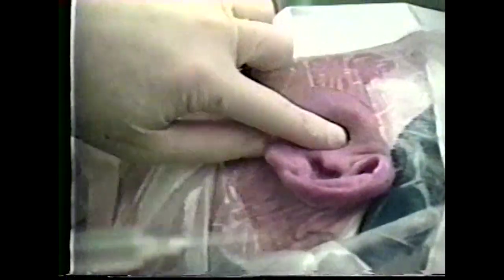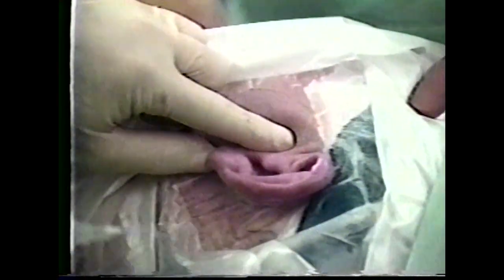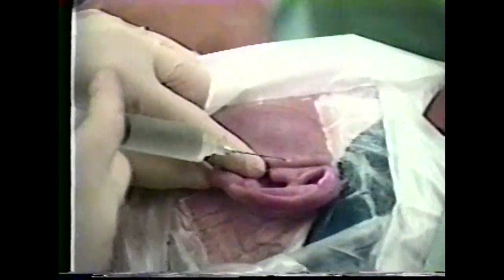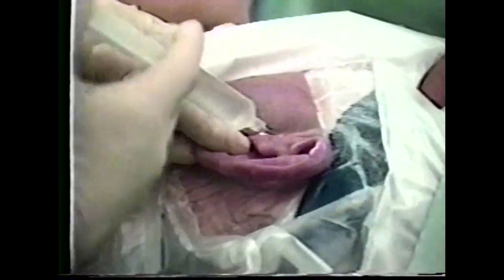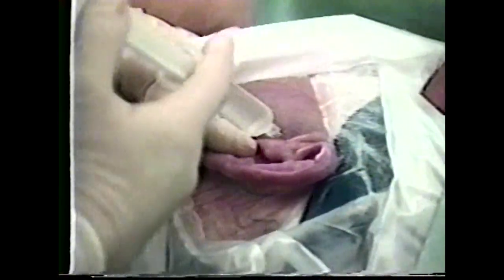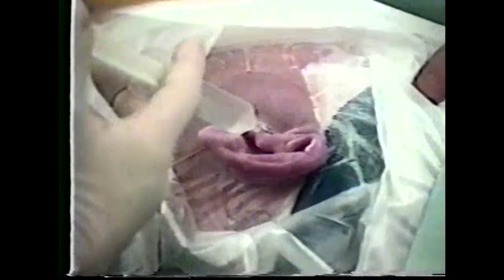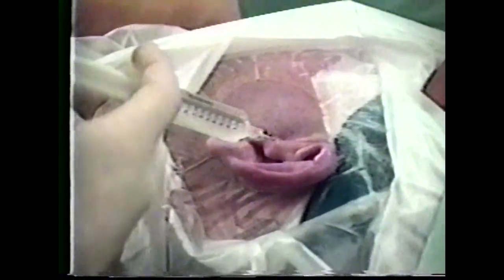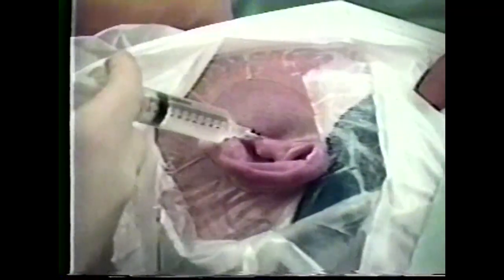After placement of the ear packs, the TMJ is palpated and the initial infusion is accomplished with a 10 cc syringe of iced heparinized lactated Ringer solution. The concentration of 2,000 units of heparin per liter of fluid will help to prevent blood clotting in the joint, which would otherwise block visualization. A back pressure or hydraulic action will be clearly felt as the joint is completely distended.